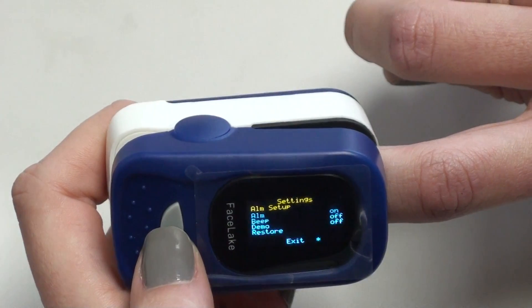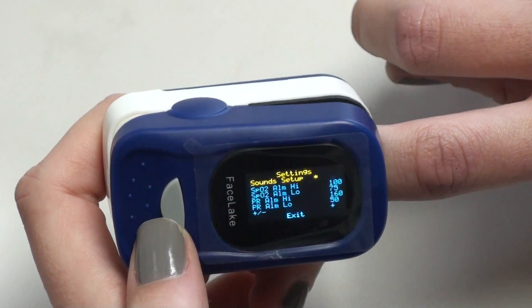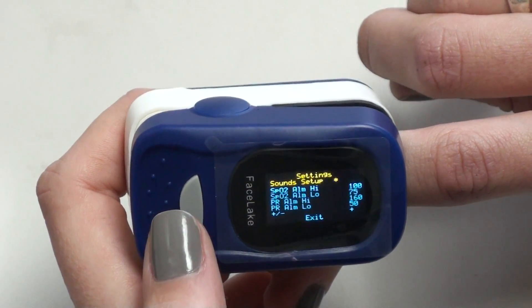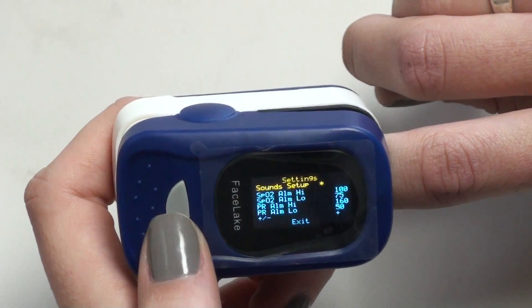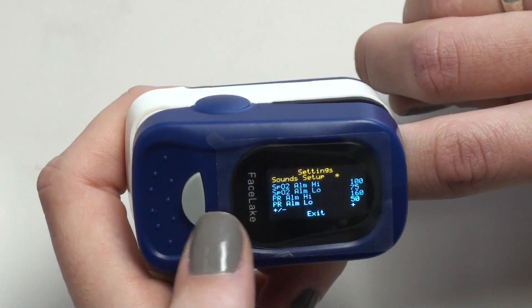We're going to keep the beep in the off mode. Then you hit the button several times and go to the alarm setup, and hold the button down for several seconds — this will take you to the sound setup. The first two, SpO2 alarm high and low, are for your blood oxygen level. We're going to keep the high at 100 because it's out of 100, and the bottom two are your pulse rate high and low numbers.